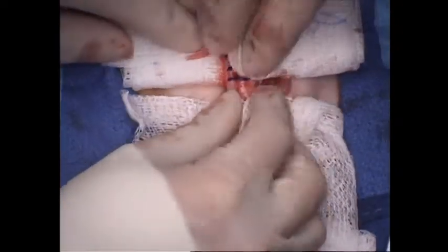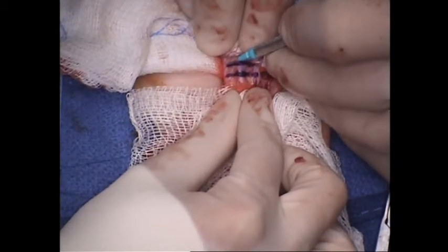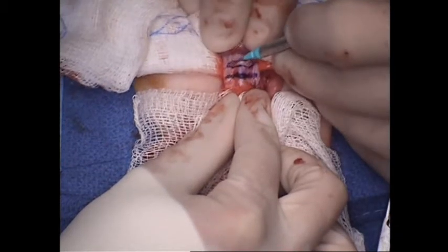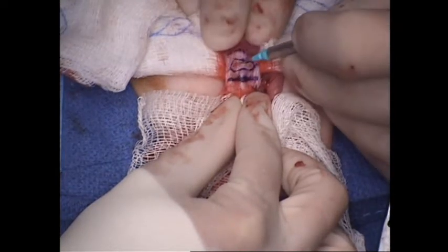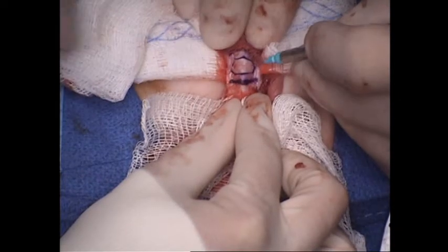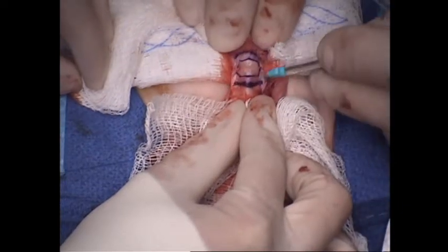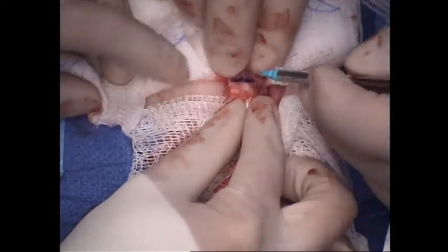It's easier to make this incision with the tourniquet on to see, and then with some tension, start in the middle one because that's the most bent place. The goal of this incision is to go through the tunica albuginea, but obviously not into the actual erectile tissues. So it is a full incision, just as though you were going to do a corporotomy and grafting. We cut just as deep, but we don't spread and open it wider. But see how much that opened just that one incision. Now we'll go below that.